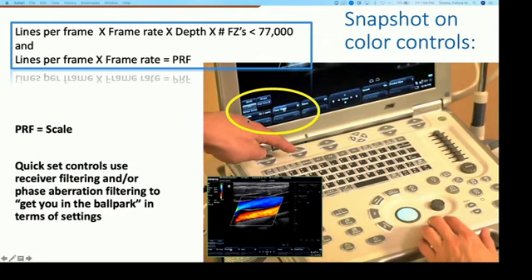And you have to remember that everything has a limitation, and it's this 77,000 law. And eventually you might come to a place where you can't fix your image. It's probably not you.